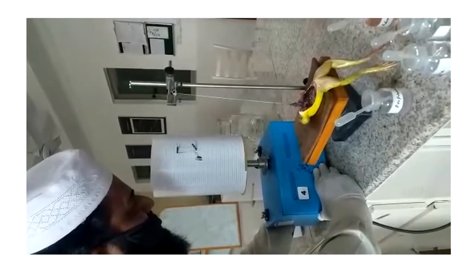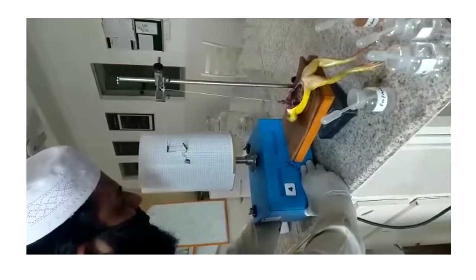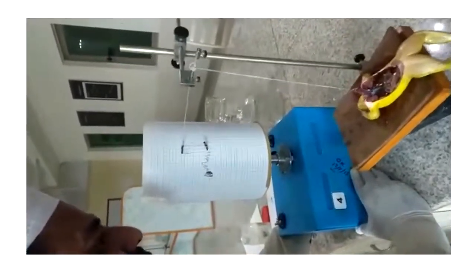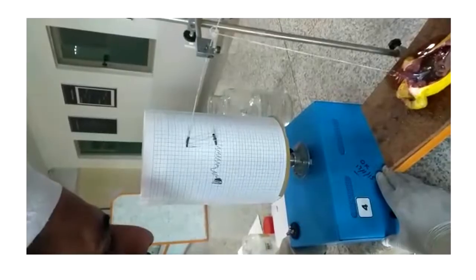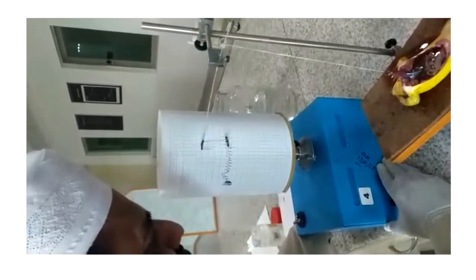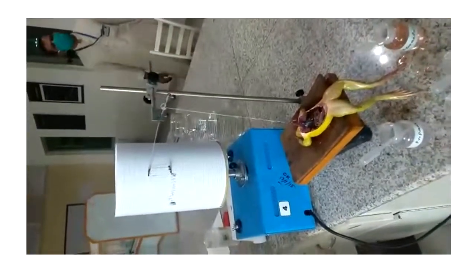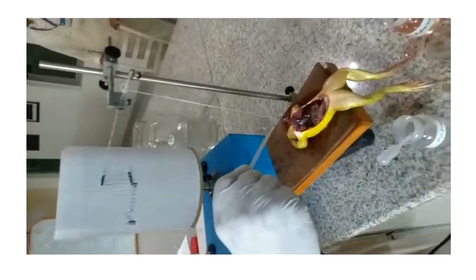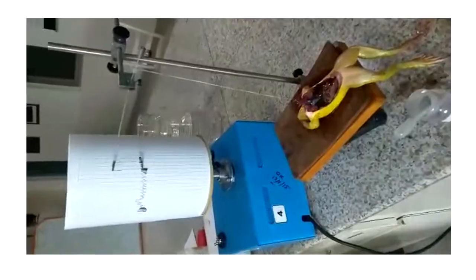Okay, so this is the practical and we are taking normal reading for 30 seconds. Stop. Okay, now we will add adrenaline to it. A little adrenaline, not too much. Start.